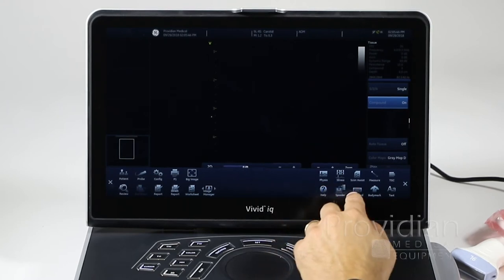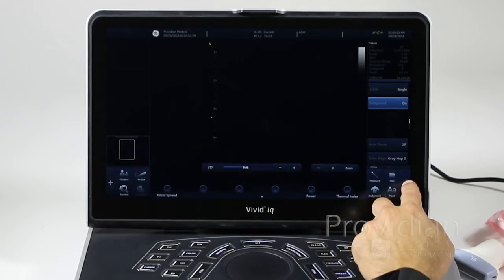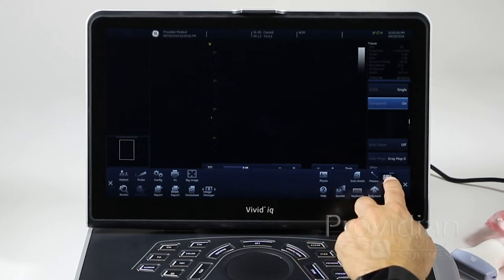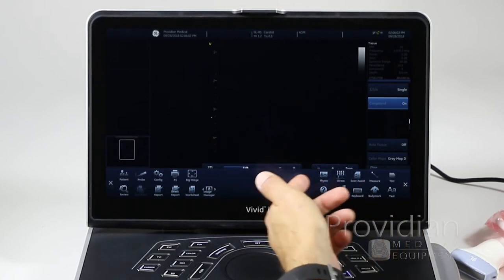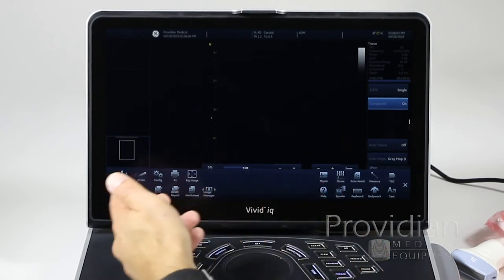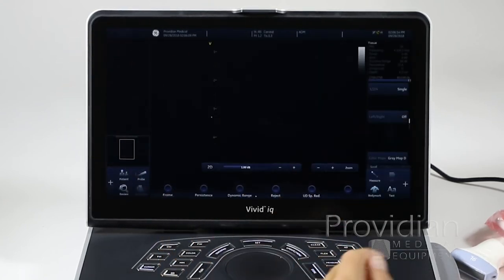You can move items around in that menu. For example, if you want the keyboard to show, press the plus icon, click and hold an item, then drag it to swap spots. You have options like physio scan assistant and your DICOM spooler, which you'll use if you're sending things to a DICOM server.